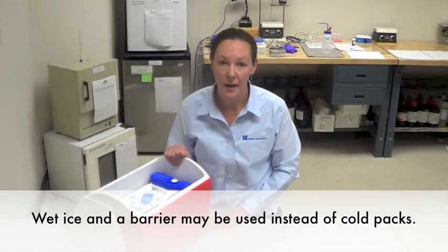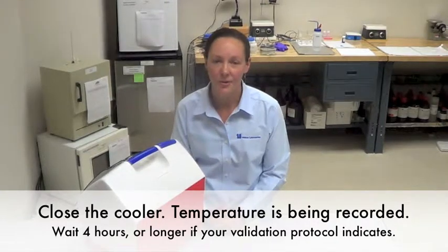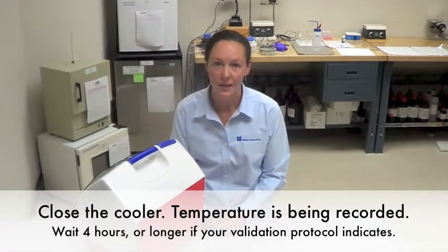In your facility, you may use wet ice as well using a barrier. Close the cooler. Your temperature recorder is recording. Wait four hours at the minimum, or longer if needed.